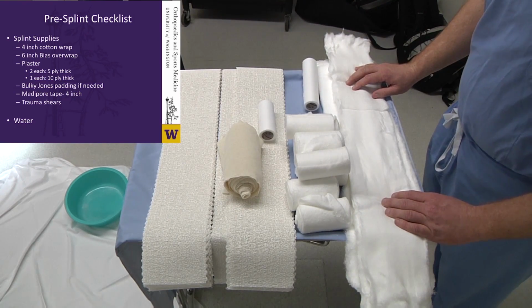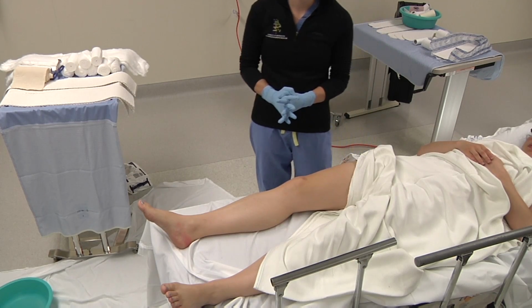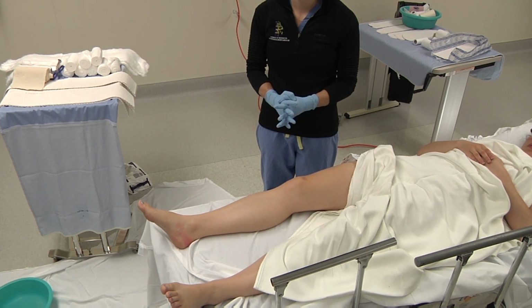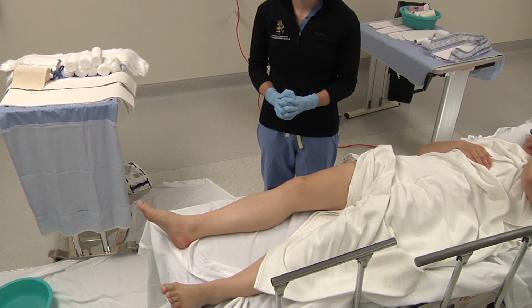Those are our supplies. So this is a simulation of putting on a short leg splint as we do at Harborview Medical Center. We have already performed our physical exam of our patient. We know their neurovascular status. We have evaluated their leg for any wounds. We have appropriately dressed their wounds. We have gotten all of our supplies. We have water, lukewarm temperature.